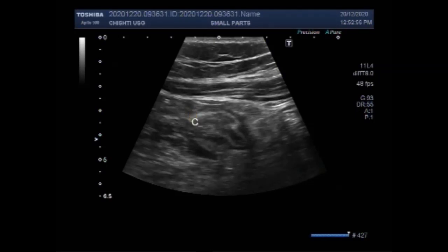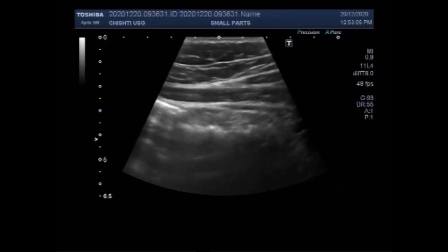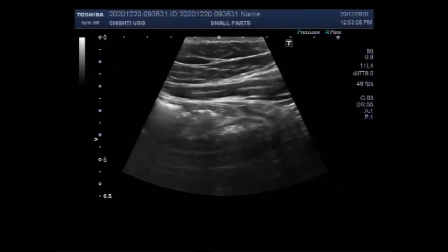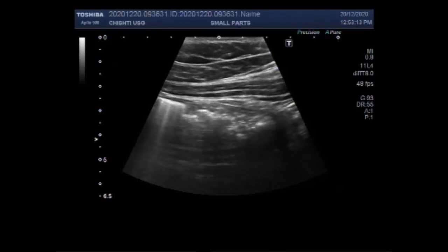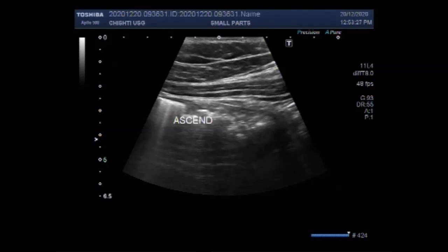Now this is the cecum. This is the ascending colon. The position of the appendix is variable from patient to patient, so you will have to look around the cecum to localize the appendix.